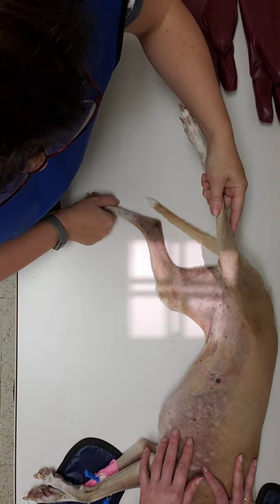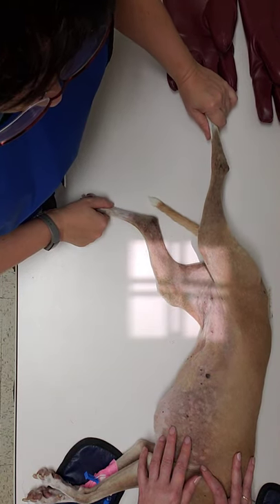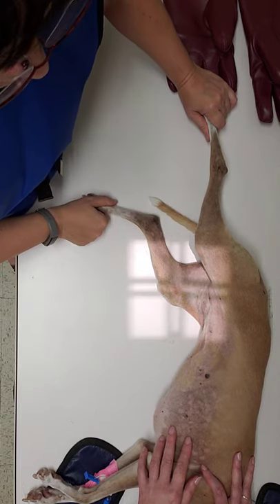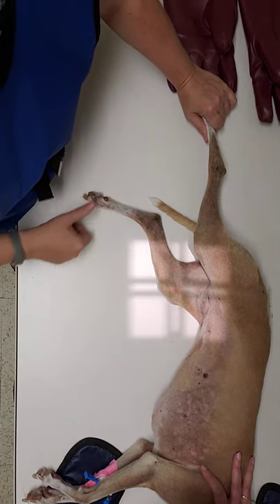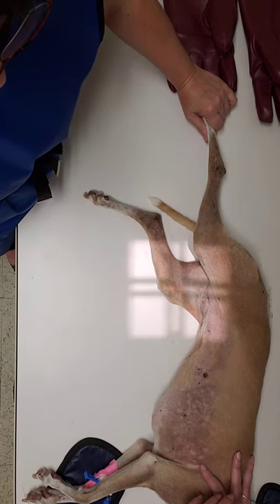If you can't rotate it so much, you can pull it backwards in some animals. It's just going to depend on how thick their legs are and how furry they are. If it's a male dog, you don't want to have the prepuce over top of the joint because they do have a bone in their penis area. And that's pretty much the collimation for a stifle joint.